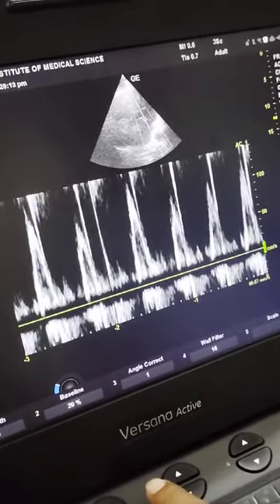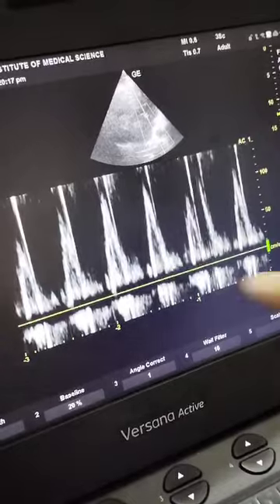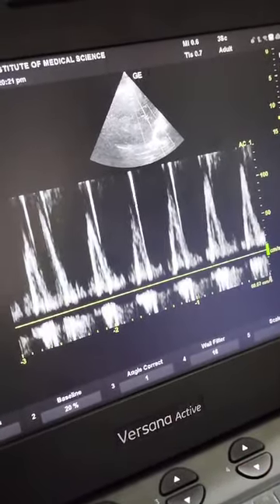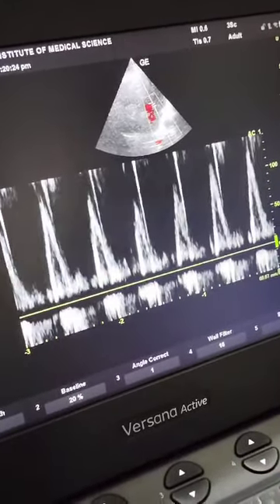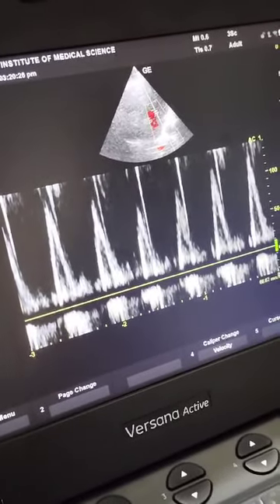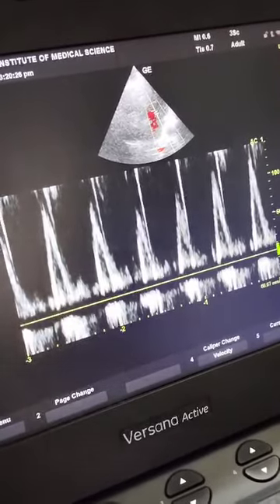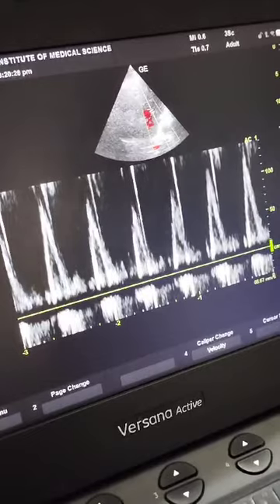Right. So you see, this is another marker for diastolic dysfunction. If you have the E wave which is very high and the A wave is proportionally not that high, that's another very important marker. And then of course you have to see the deceleration time and all that. So this is again a very important pointer towards diastolic dysfunction. So two things are correlating: the mitral annulus, and this one. Both are correlating. So good. I think we will keep it here.